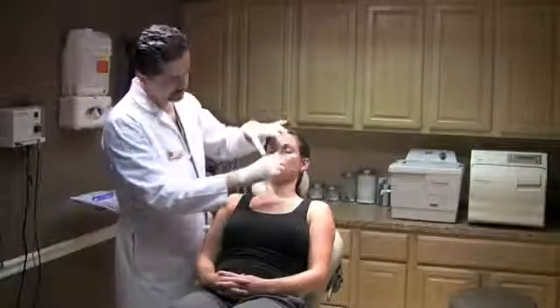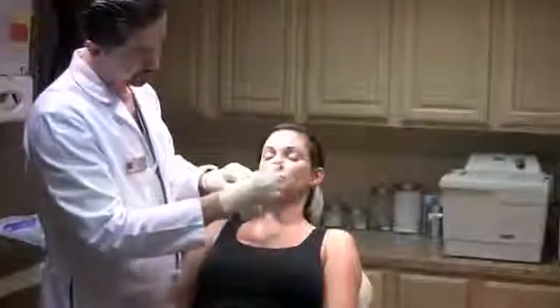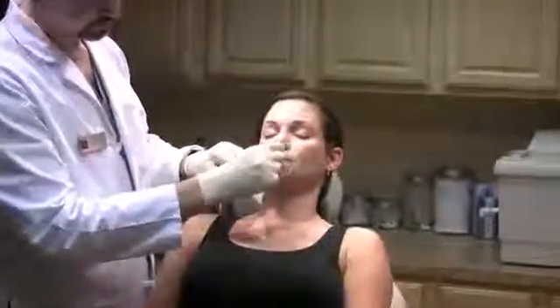Okay, so we've had enough time for the dental block to work. She's numb. We're going to start with the Juvéderm injection. What I like to do is take an alcohol wipe and just basically wipe the lips. Take any lipstick or anything else off.